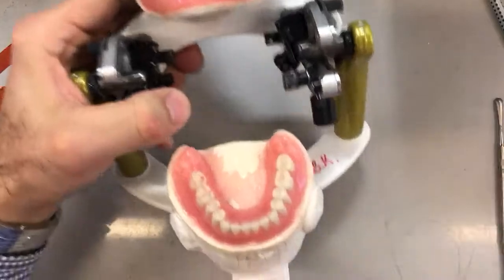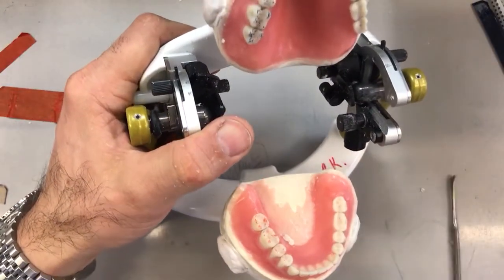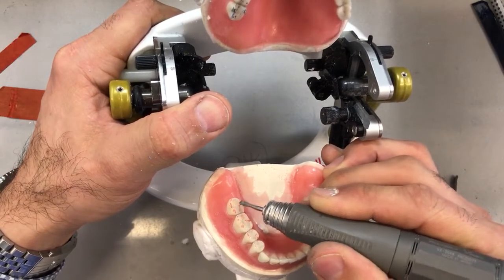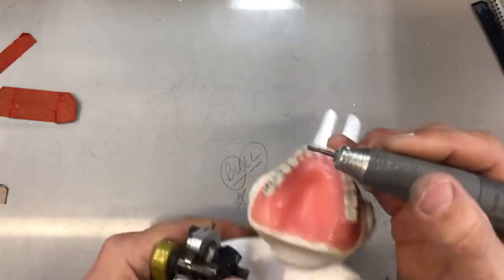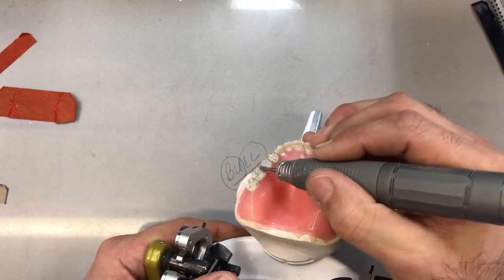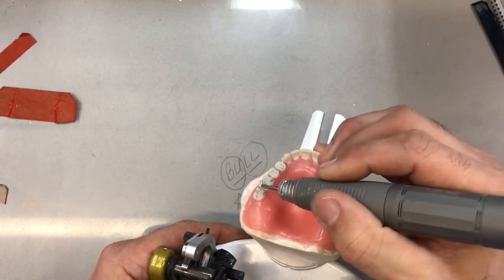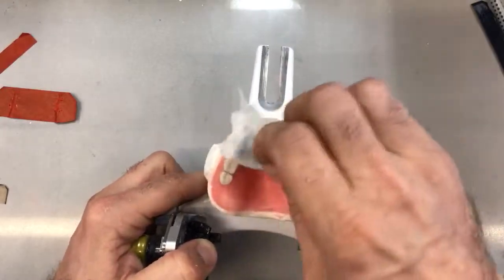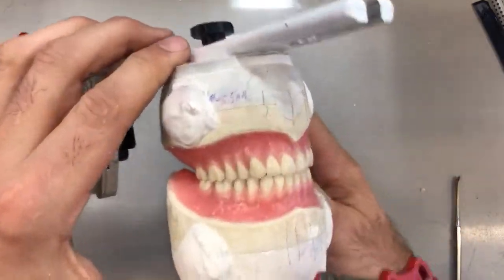Seeing what we have: there's definitely more interference here — a definite premature contact way back at the lingual of the 17s. I'm going to reduce that. As far as the upper is concerned, I'm going to turn again at the 17s. I'm working around the buccal cusp tips to maintain their height, otherwise I will affect the plane of occlusion — at least the aesthetic aspect looking at it from the front.